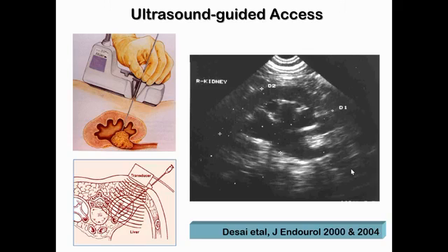And you can identify a hydronephrotic kidney, the fluid, so easily. And if not, you can inject fluid through the ureteric catheter. You can give a diuretic to distend the pelvicalyceal system to make your identification easy.